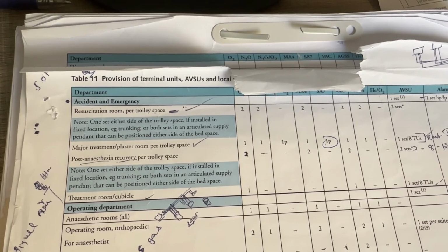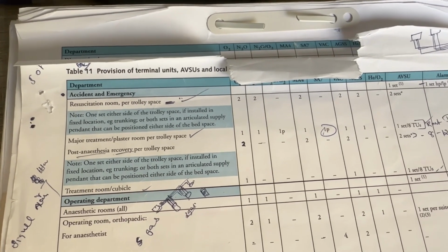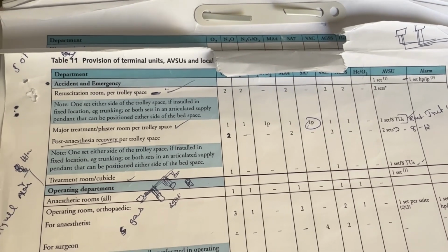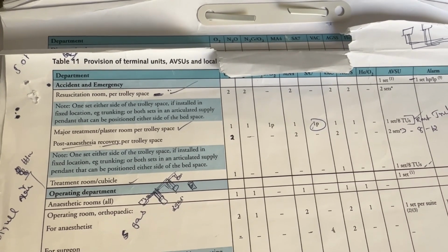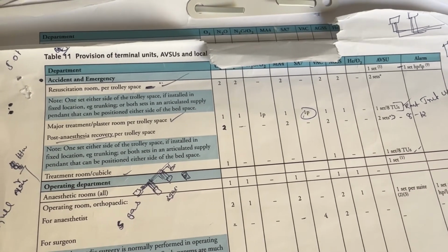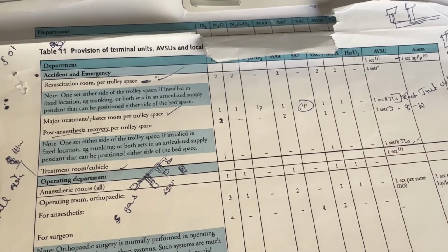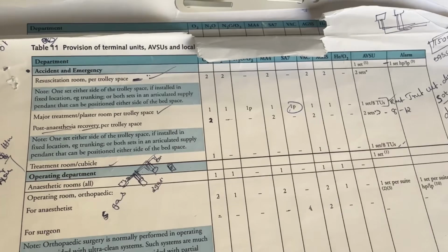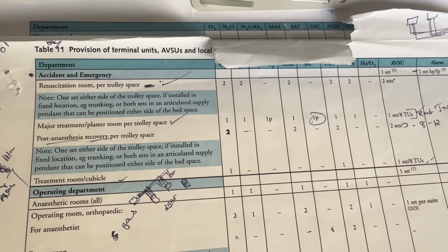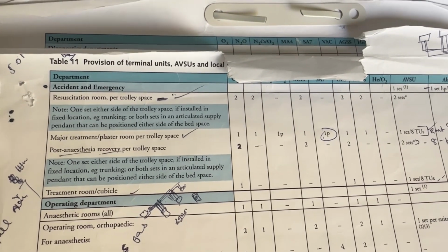Most of the PICU we give a bedhead unit, and rarely a wall outlet, to keep the medical equipment, light and rail in a single compact unit. So we need on the left side one set of O2, medical air, vacuum, and on the right side O2, medical air, vacuum, with dual circuit.